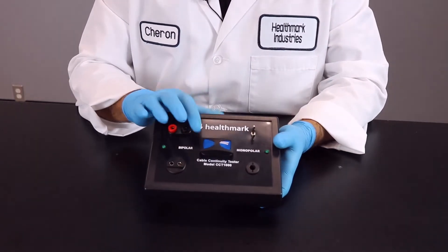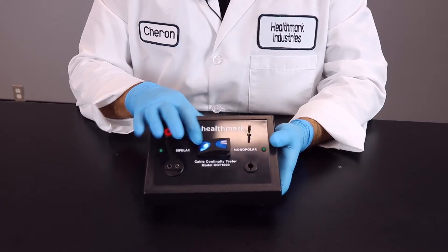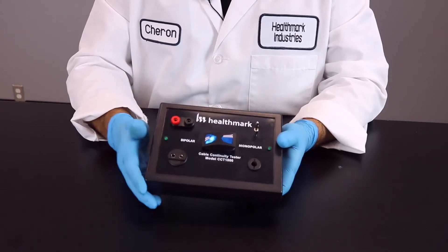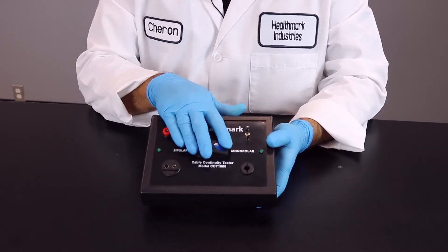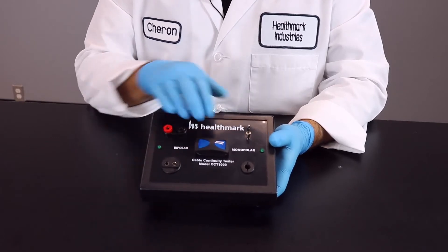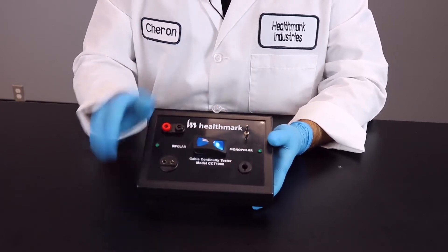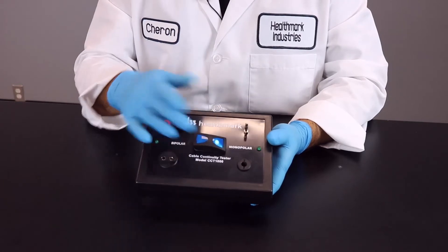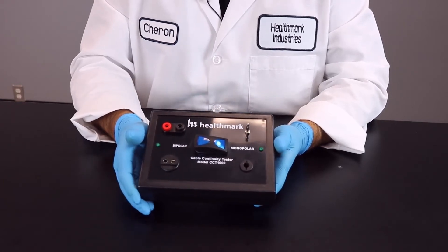In the front, you're going to see a toggle switch that you simply move towards bipolar to test your bipolar cables and cords. In the middle, we'll turn that toggle switch or the unit off. And then you notice here, to test your monopolar, you will toggle the switch to that side.